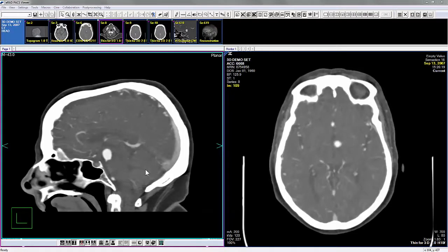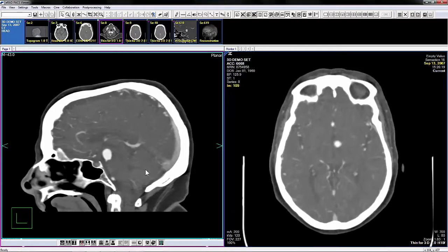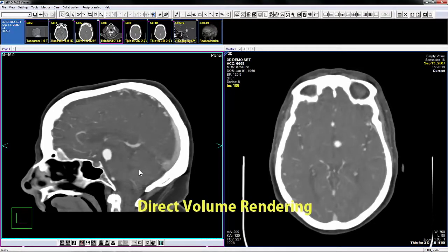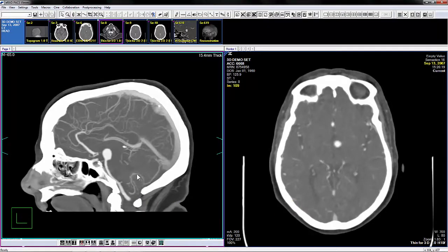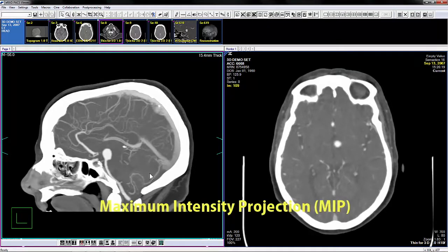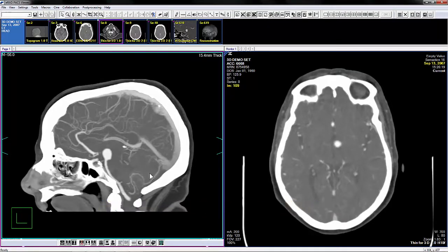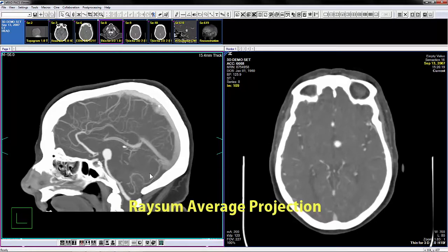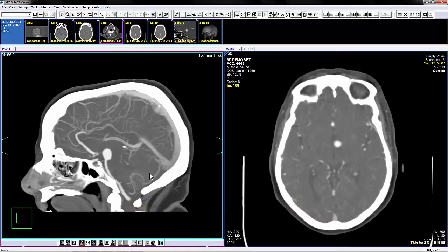Available projection modes are Direct Volume Rendering (DVR), Maximum Intensity Projection (MIP), and Ray Sum Average Projection. Each option has its own icon on the toolbar as well as a keyboard shortcut.